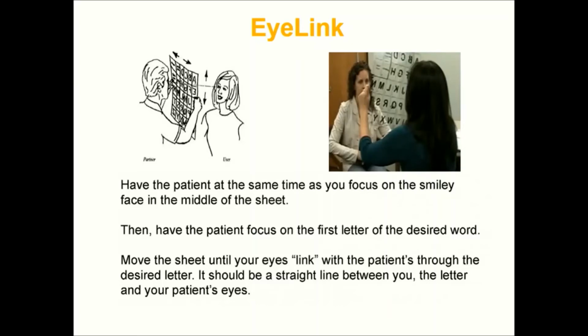And then you know that you've selected the right letter. So there's a lot of moving around for you to do with the chart. And it can be a little bit intense making eye contact with somebody. Some clients don't like it, but it can be quite accurate, really, because once you've made the eye contact, you definitely know that you've got the right letter, and there's slightly less cognitive load because there's no encoding or color coding in this system. So that's worth having a look at.